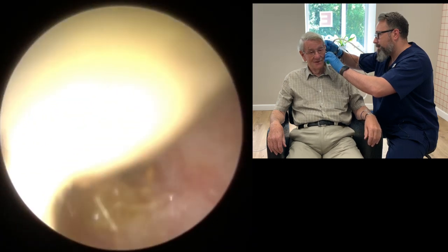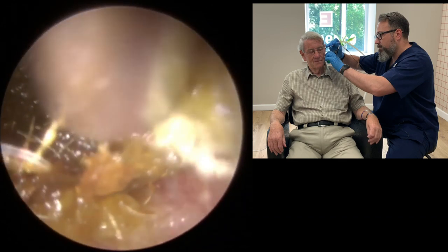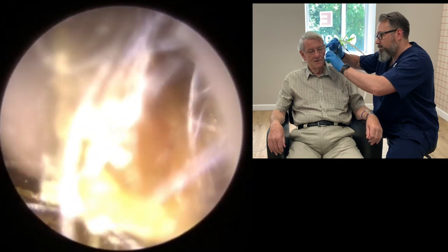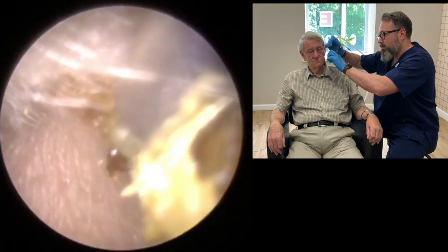So you can see from the video that when we get these large pieces coming away, they stick on the end of the suction tube. So you have to clear that away before we can get the next section. So you can see it unsticking from the canal wall again. Another large chunk coming away there.